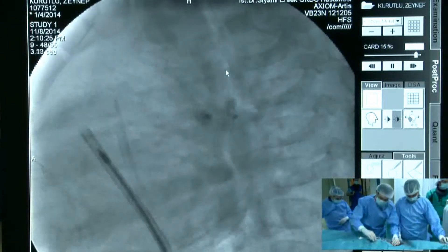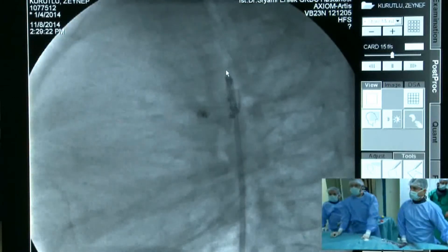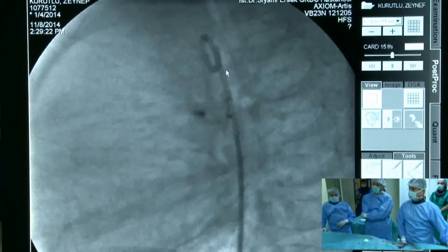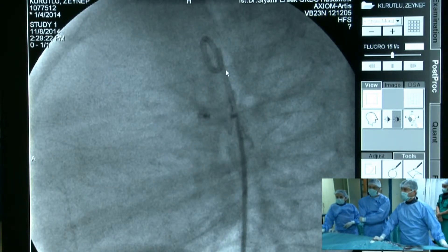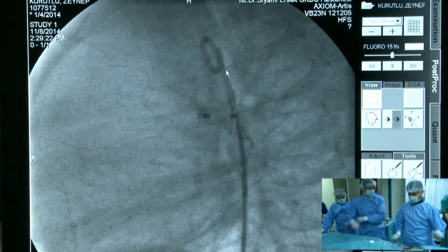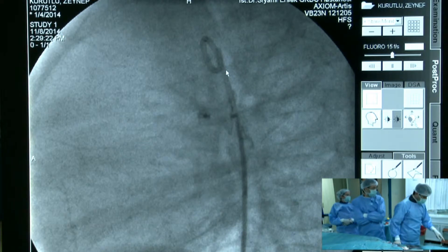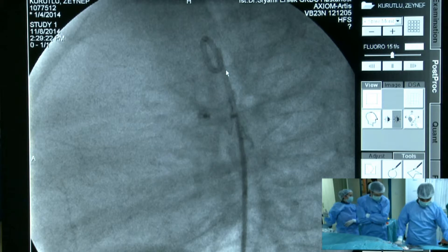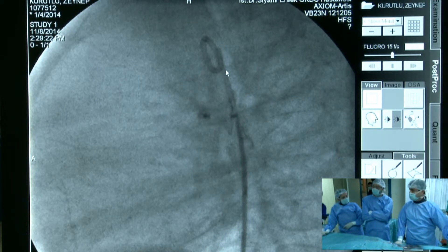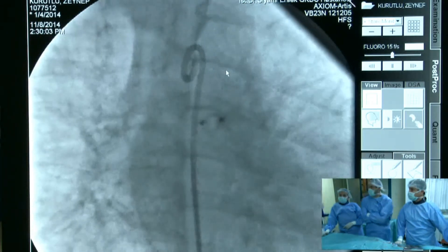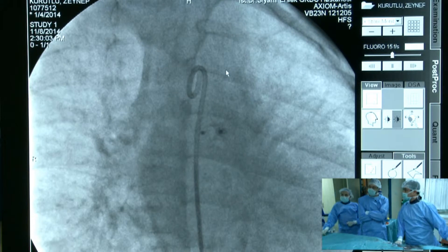Whether cranial angulation is needed depends on the size of the patient — for a one-year-old, RAO alone should be sufficient. My concern is that in this small child of seven to eight kilograms, the configuration of the ADO1 may not be ideal. Normally it should be shaped like a mushroom, with the pulmonary artery portion clearly fixed. In this case, the waist of the device appears to be placed within the tunnel of the PDA, which may carry a risk of dislodgement.